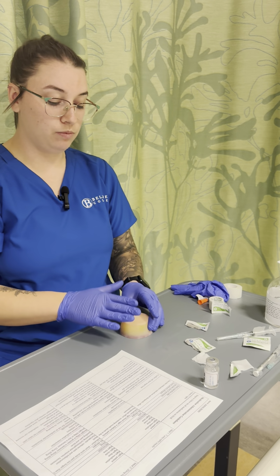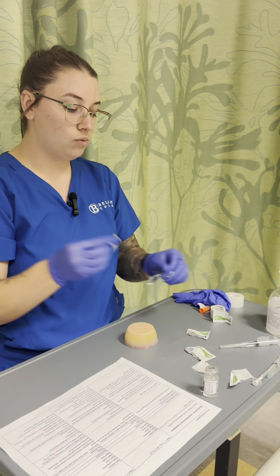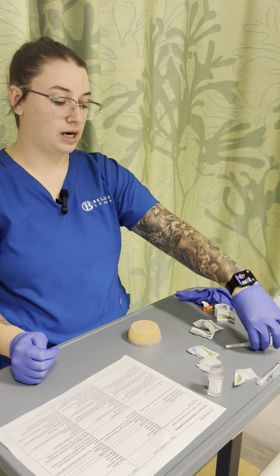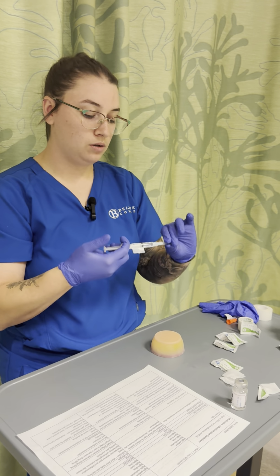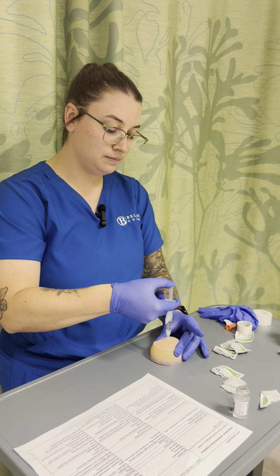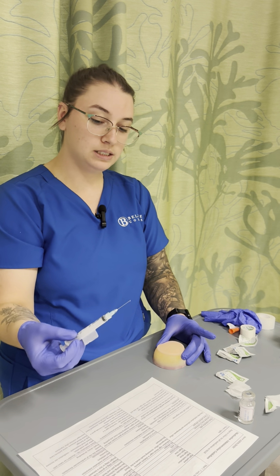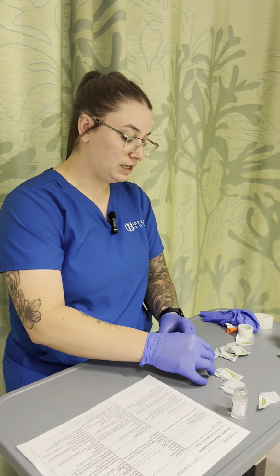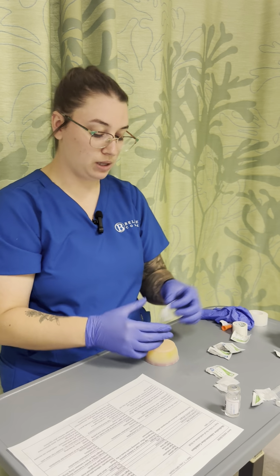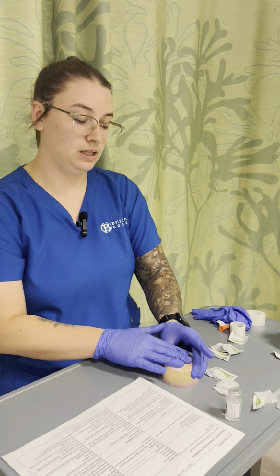And then for purposes, we'll also now pretend that this is a deltoid per patient's request. Once again, we would clean and we would wait for that to dry. We would insert the needle at 90 degrees. All right. This does not have a safety mechanism, so I will recap. And again, this will go into sharps, and I would apply pressure and a Band-Aid. All right, and then that is done.